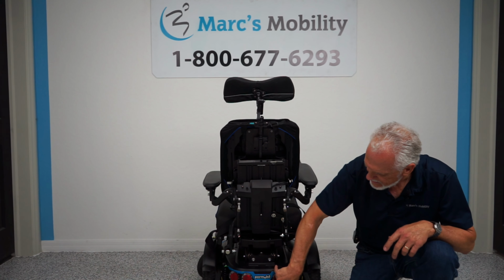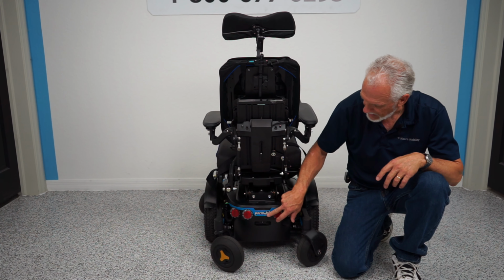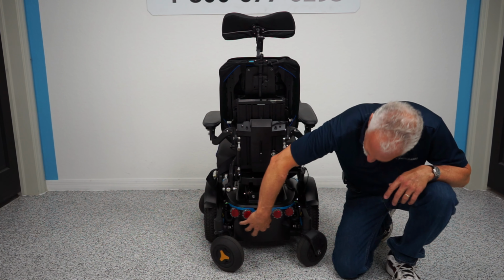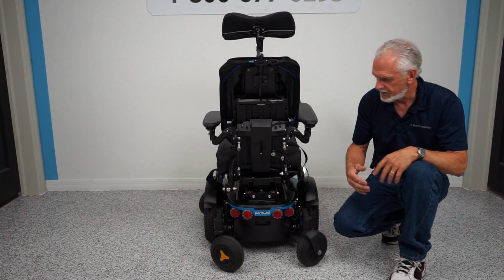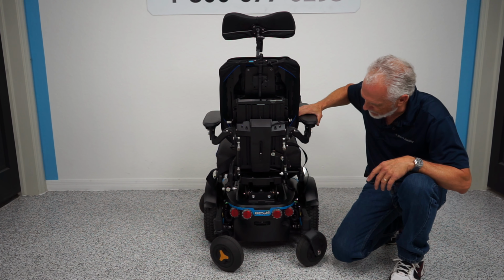There's a power button right here. When we ship these chairs, we always turn it off. I just turned it off. You just turn the power off. There's no more power up front. So when you get your chair, you need to go here, get your fingers in there, push the lever on, you'll hear it click, and then turn your power up front. Then you got to go to the front, turn the power back on, okay?